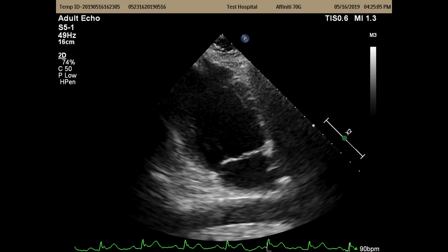If you think of the apex of the LV like a cone, and you're going from a 4-chamber to a 2-chamber, if you haven't spun the probe such that you're lined up with the anterior wall, you'll get strain data, but it's not actually the anterior wall. It's some amalgam of the lateral wall and the anterior wall. It might be anterolateral. So pay attention to your little cues, and one of them is the Coumadin ridge in the LA.